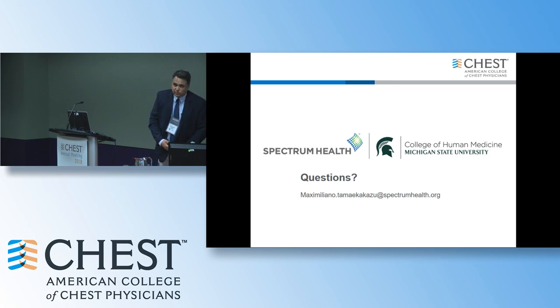Since you use it in select patients, what transpulmonary pressure do you shoot for? That's a good question. Usually we use transpulmonary pressure below 20. Although the studies took a threshold of 25, we use it when we have patients that have a very high plateau, and we are not sure the cause, and patients have morbid obesity or ascites or pleural effusions, and we think that we don't need to prone the patient. We just try to find out what is the transpulmonary pressure and if we have room to increase the PEEP. Sometimes when you have that high plateau, it's not easy to do the lung mechanics in a non-invasive way.